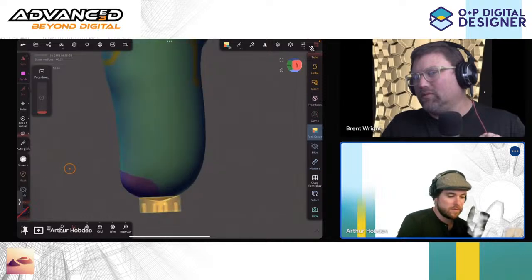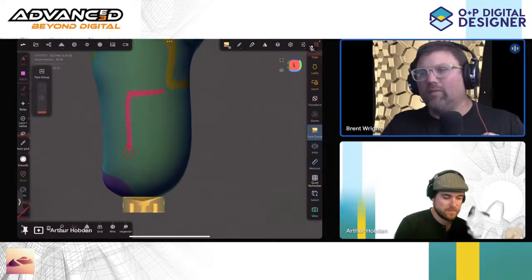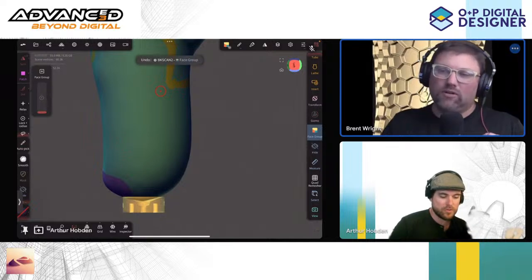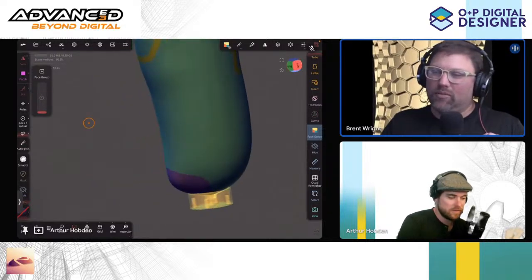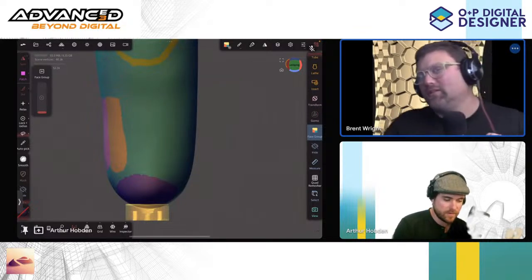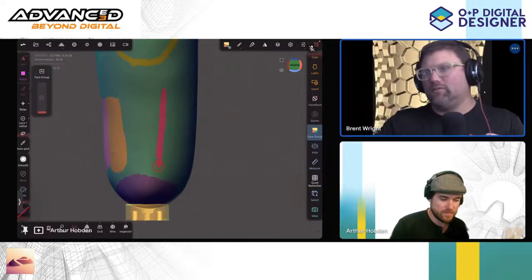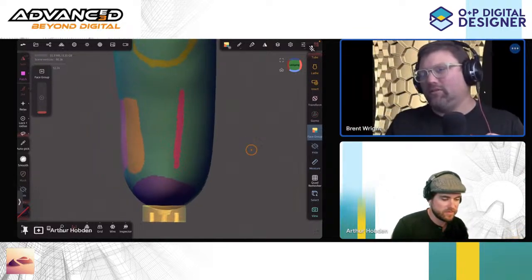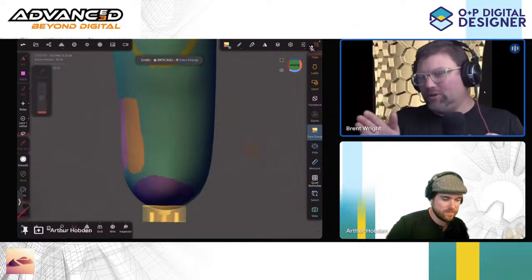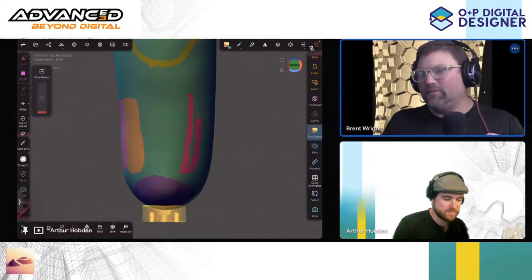So just the orange side, or the pink, whatever side the orange is on. Okay, nope, don't do that. Let's try again, a little bit further central to the right. If you feel your shin bone and then you feel that soft spot after your shin bone, that's where you're going. Okay, something in there. All right.